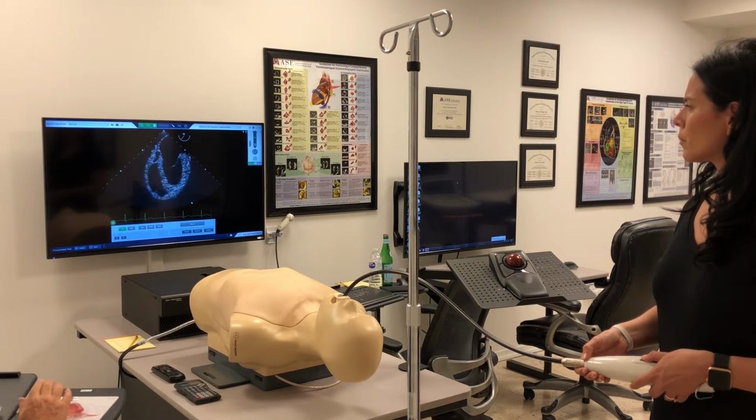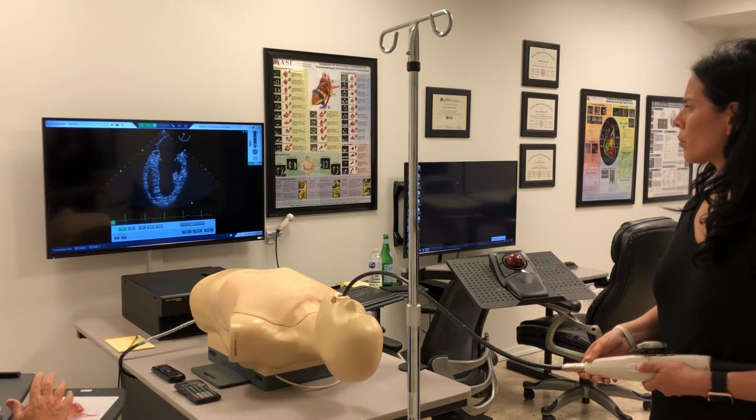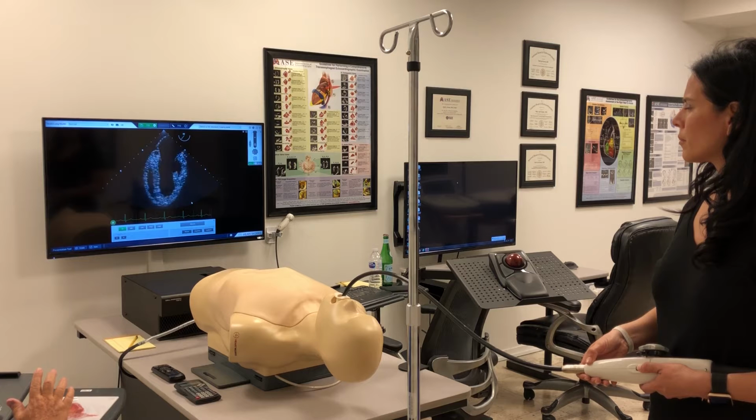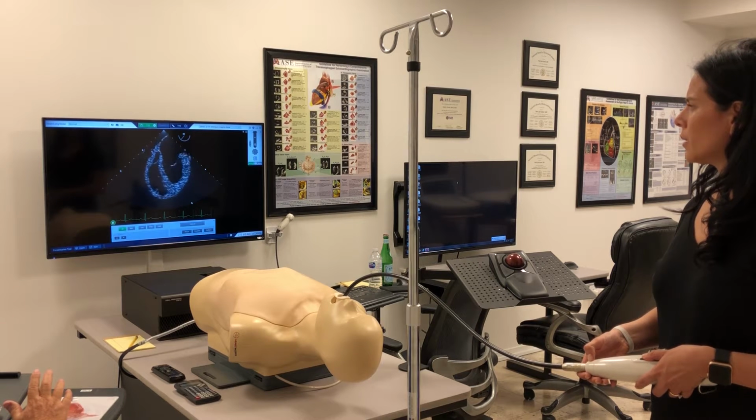So with rotation of the probe, you'll experiment right and left or clockwise, counterclockwise, till you get the trapdoor look of A2 coming up in the middle of the P1 and P3. Right there, good. Now just quickly, let's show all the P scallops, P1 through P3. And you have to decide, well, is that a left turn or a right turn? There. Those are all P.